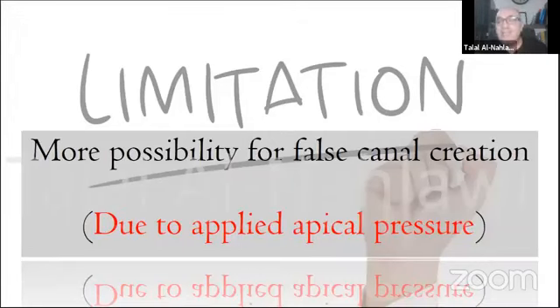The fourth limitation of bypass is that sometimes we try to create or to find a gap between the walls of the canal and the broken file. But sometimes we will not be able. We have to admit that not all the cases are bypassable. I believe 100%, and so many endodontists listening to me now are moving their heads, they agree with me. Not all the cases are bypassable, okay?